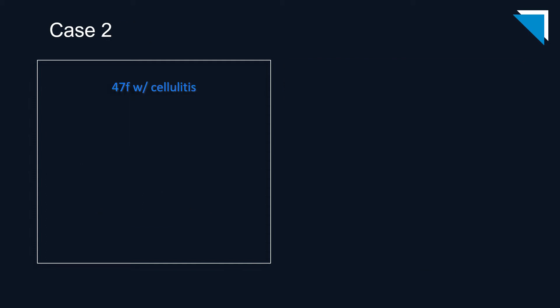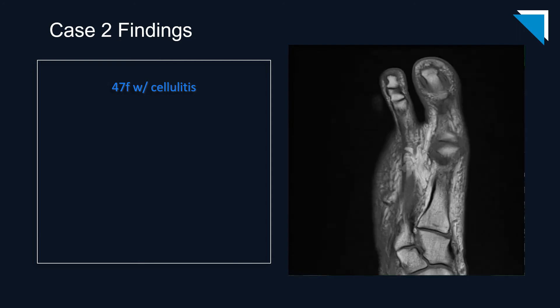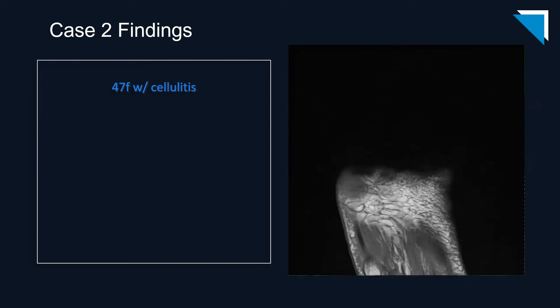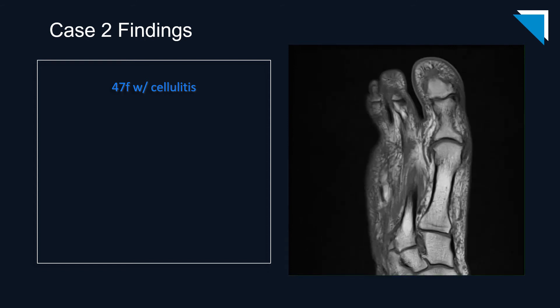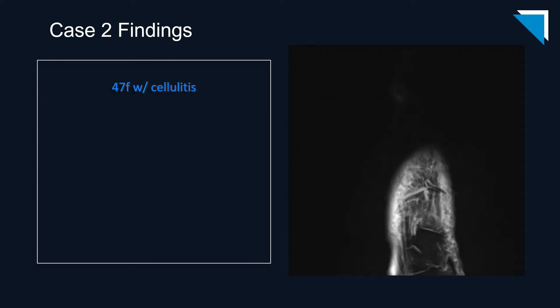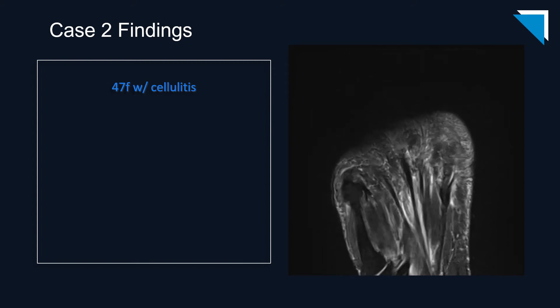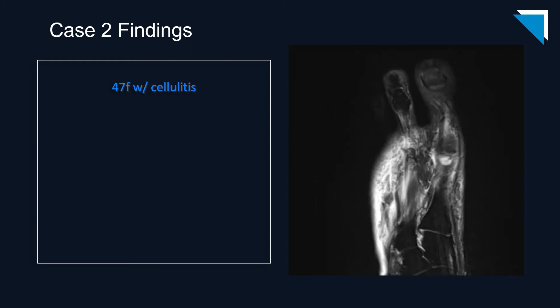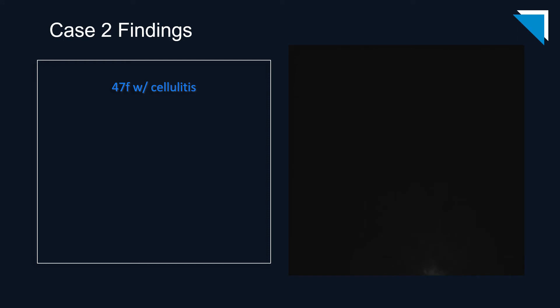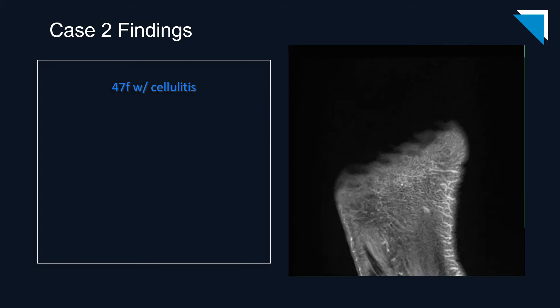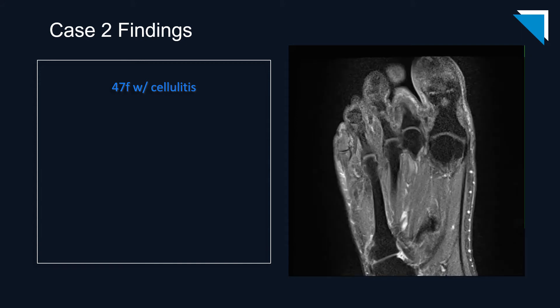Our next case is a 47-year-old woman with cellulitis. I like to begin with the axial non-fat suppressed T1-weighted sequence to evaluate osseous architecture. There are some mild degenerative changes, but nothing really stands out — no erosions or areas of marrow edema. I do see a little soft tissue ulceration abutting the hallux distal phalanx. Moving on to the axial fluid-sensitive sequence, I notice diffuse soft tissue swelling and subcutaneous edema, and my attention is drawn to the hallux distal phalanx, where there is bone marrow edema. We were fortunate to have post-contrast images, which show some subtle bone marrow edema in the hallux distal phalanx.